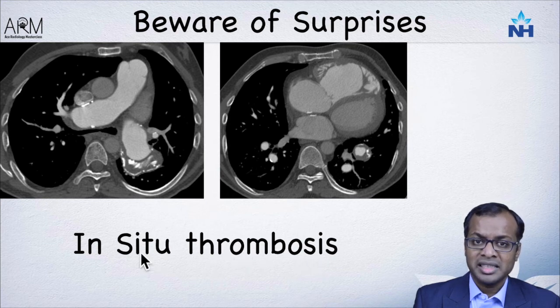This is an entity which is seen in severe PH, and there is secondary thrombotic disease, just like the aorta, where the pulmonary arterial pressures are so high that there is atherosclerosis. This is an entity which should not be operated on. Patients will not recover from the surgery.